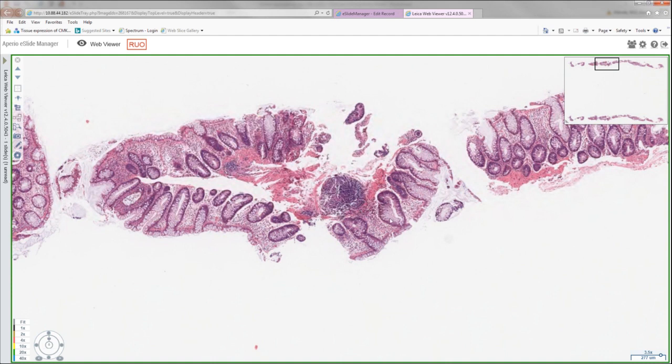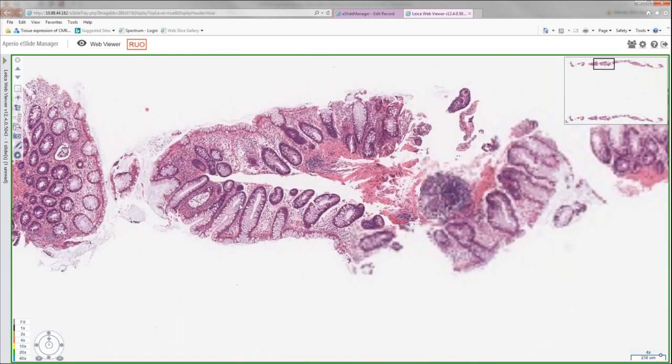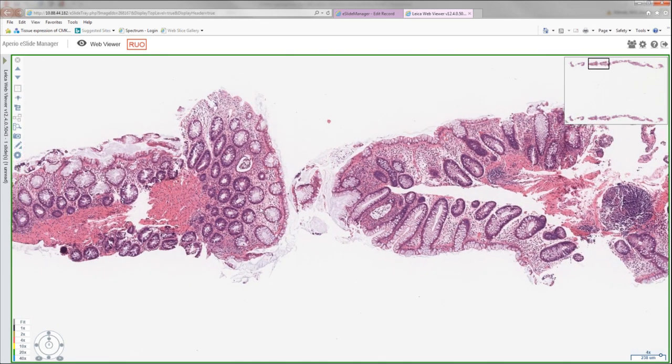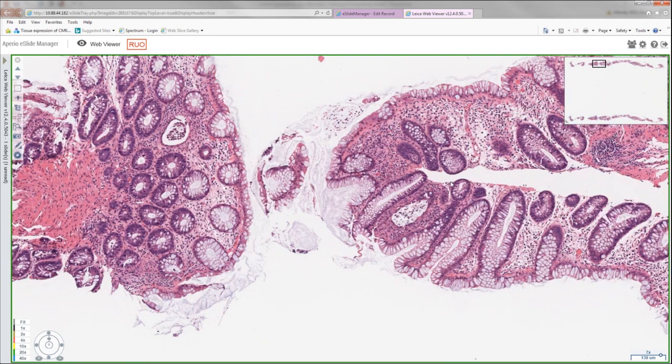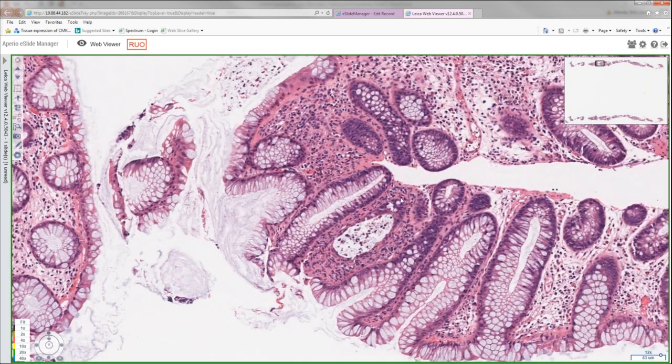That is frequently seen. It doesn't mean that this patient has chronic features. It's just normal sometimes. But what is abnormal with this case is there are areas in which the lamina propria becomes a little more cellular in comparison to some areas that are more edematous. When we get closer in those areas, we can see how there is crypt injury with attenuated epithelial cells, very eosinophilic cytoplasm and hyperchromatic nuclei.